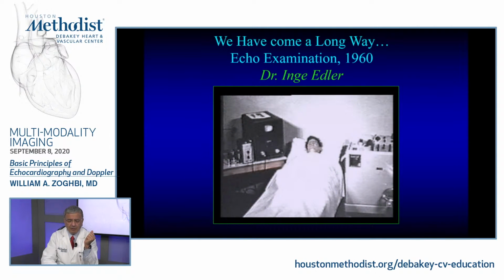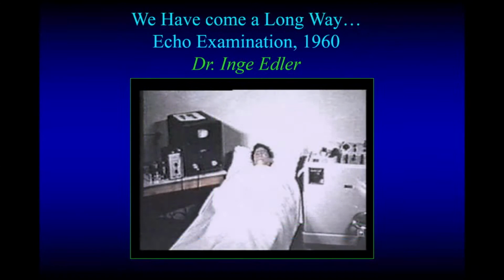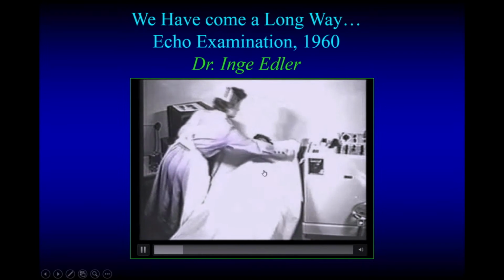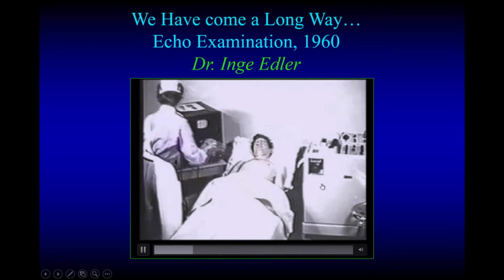I want to share with you last, actually, a video back in 1960, so we're talking about, my goodness, quite a few years ago now, 60, 70 years, of Dr. Inge Edler doing an initial examination.